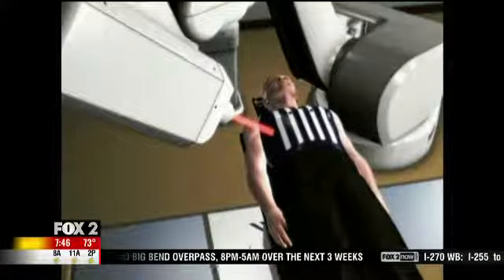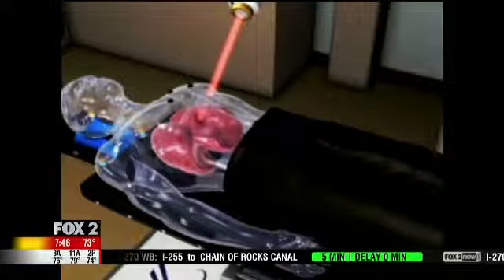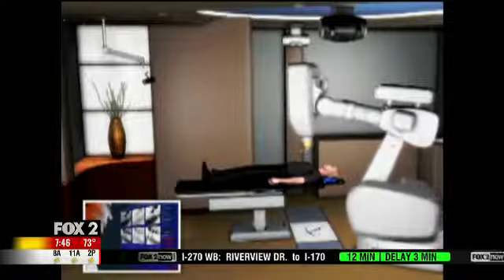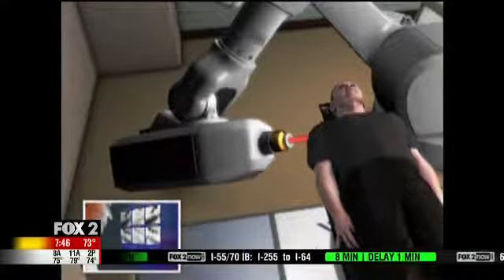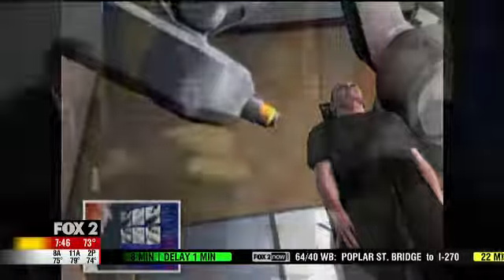Doctor, explain how it works. Now, you went in, I think, a week before, and you put in some gold flecks. We put in gold markers. The way the CyberKnife works is it sees these gold markers, and each treatment consists of literally 100 to 200 beams that come in from all around, multiple directions, and this creates a high dose volume that literally shrink wraps to the tumor, or in his case, the prostate. And it sort of mimics the dose distribution of the radioactive seed implant, which is a well-tested, very robust treatment for prostate cancer. We don't have quite as long follow-up for the CyberKnife as we do for the radioactive seed implant, but it looks as though it should be just as good.